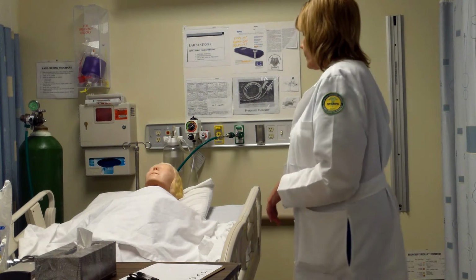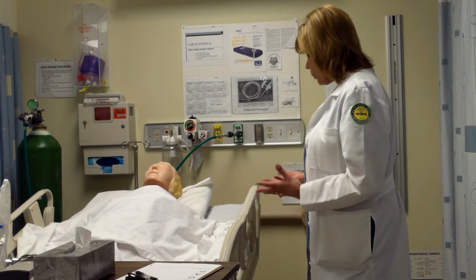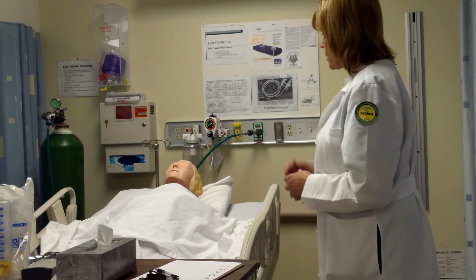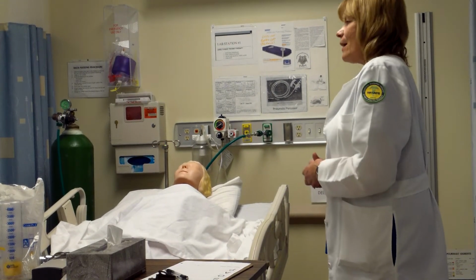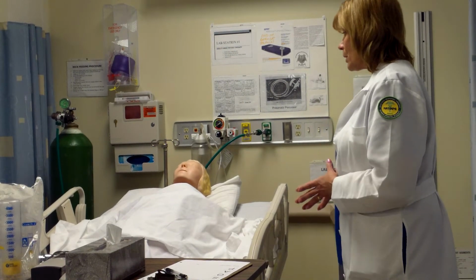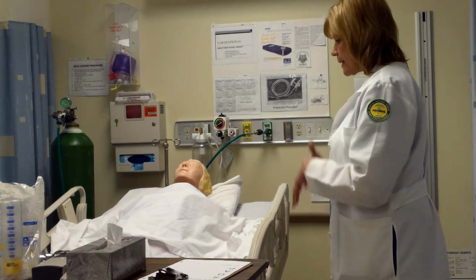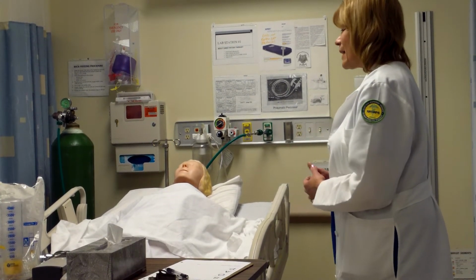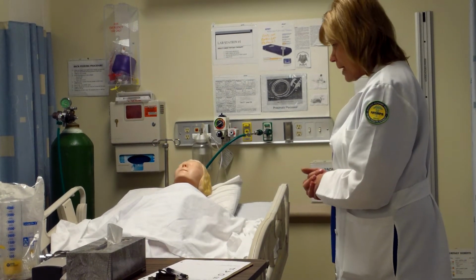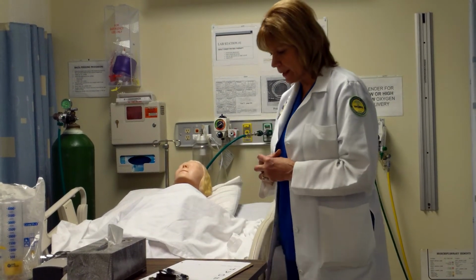My name is Mary, and I'm from the Respiratory Therapy Department, and I'm here to assess you to see if you need some breathing treatments. I noticed that you just had some abdominal surgery, and sometimes people don't like to take deep breaths after that kind of surgery because basically it hurts a little bit. So I'm going to evaluate you to see if you need some assistance in taking deep breaths and coughing, because we really don't want you to have any lung complications after your surgery, okay? So that's why I'm here. So introduce myself and the reason why I'm doing the therapy.